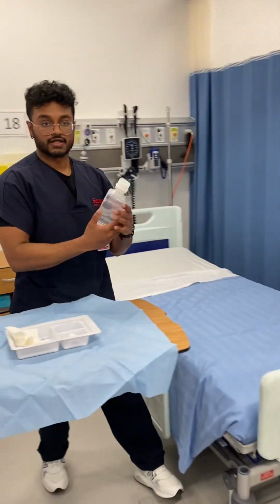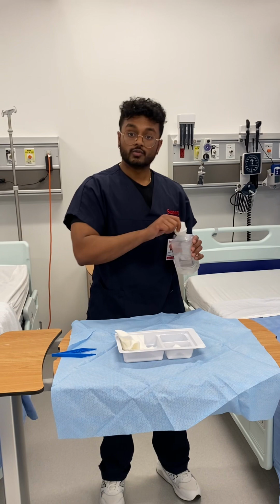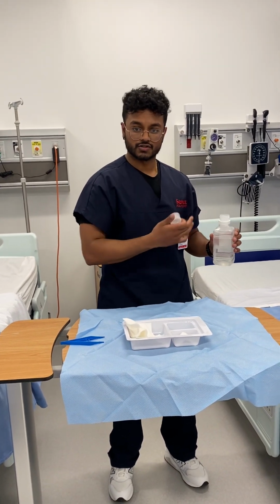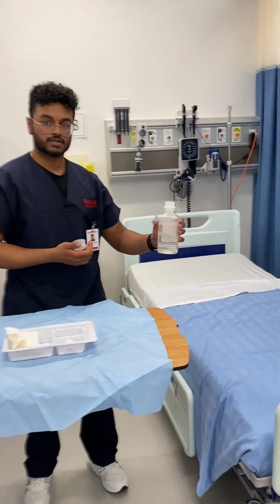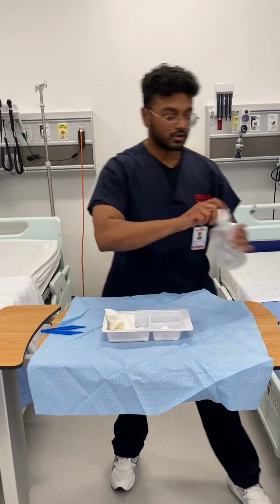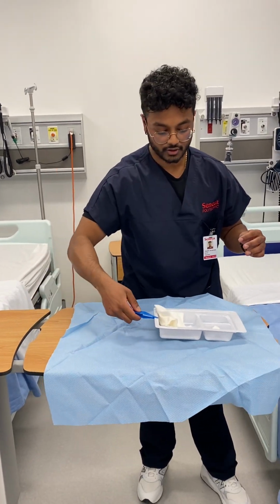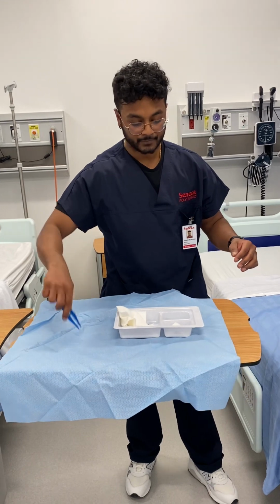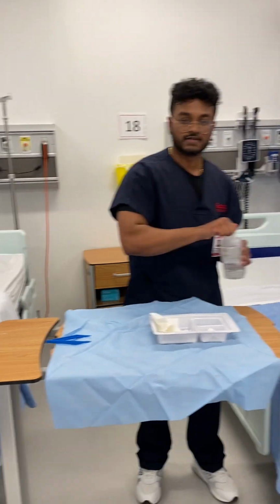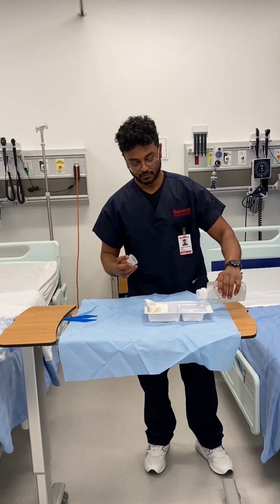Now we have to apply our sterile solution. We make sure to check it's not expired. It expires June 2025. Because it is open, we need to lip the bottle, emptying out a little bit so as to clean and ensure sterility. This is me emptying. And then we'll pour along the side. Prior to pouring, however, we want to ensure our tray is on the edge within the 1-inch border, so as to make sure any runoff does not interfere with sterility but comes off on the clean side. Making sure to palm the label. We pour.